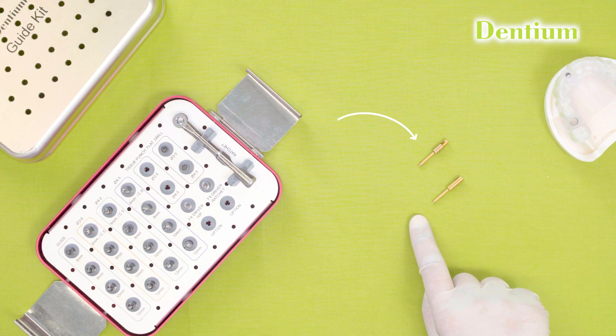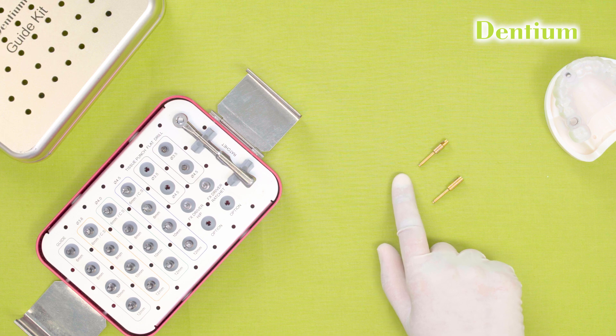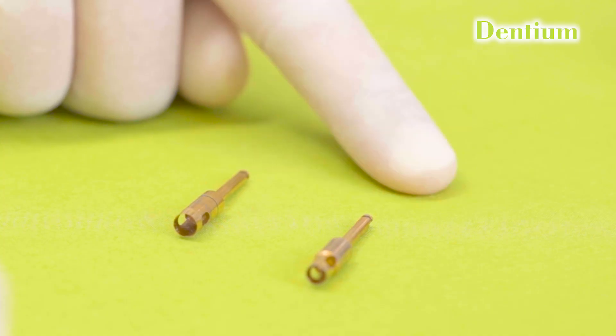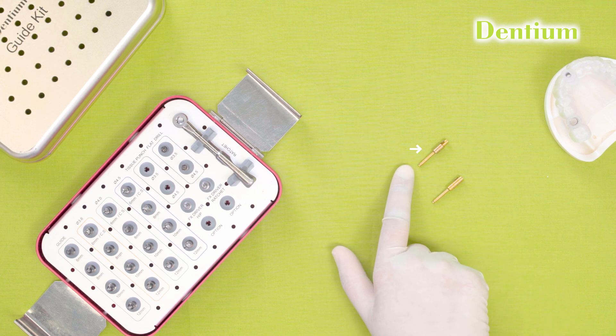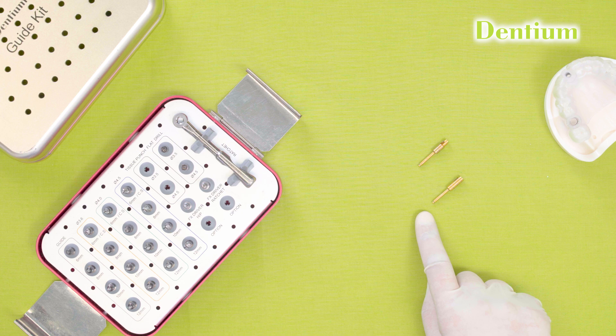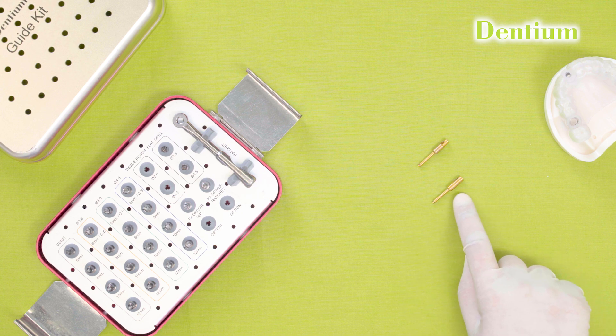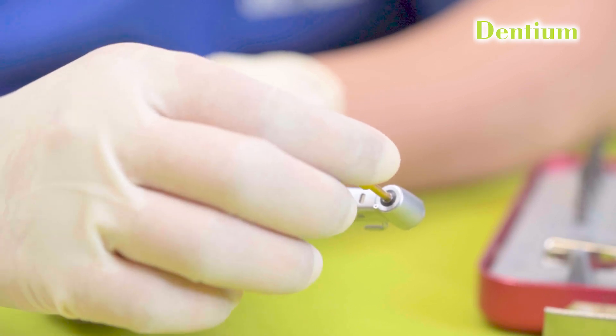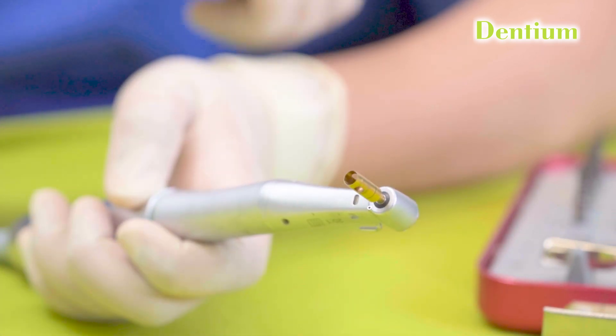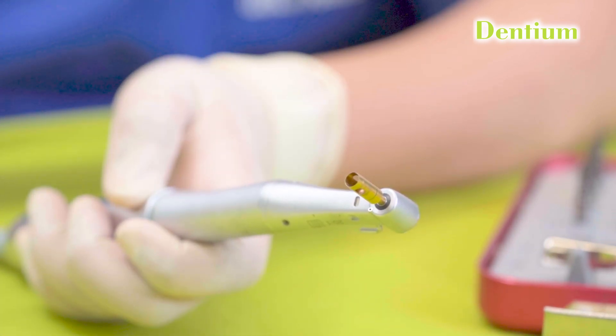Coming to the tissue punch — it is available in 2 diameters: 3.5 and 4.5. If I am placing an implant of 3.6 or 4 mm, I will be using a 3.5 mm tissue punch. If I am placing an implant of 4.5 mm, I will be using a 4.5 mm tissue punch. They are basically used to remove the tissue from the implant position, placed inside the handpiece.